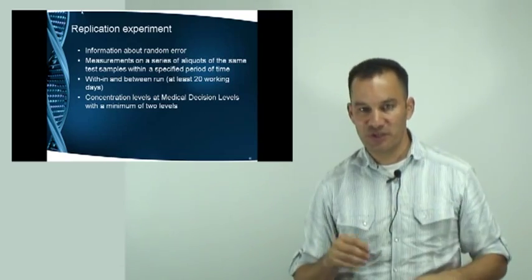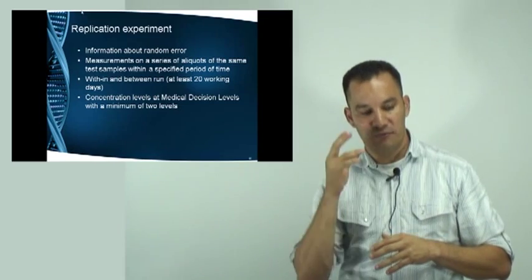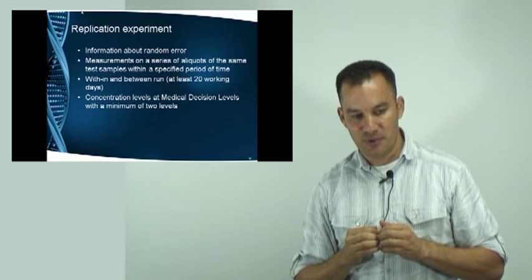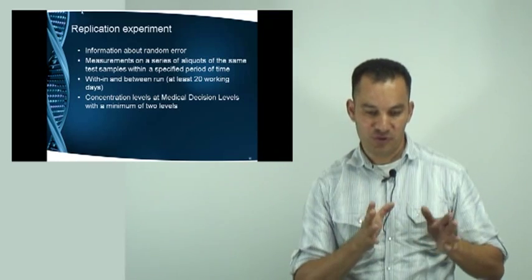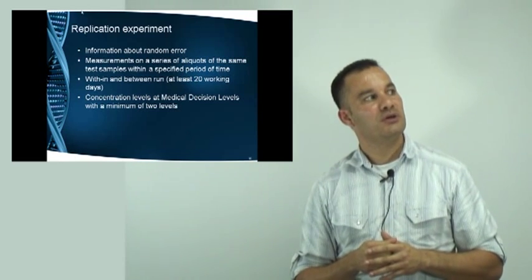The concentration at which we have to perform those experiments is being decided by the medical decision levels. You have to realize for yourselves that sometimes physicians have certain concentration levels of certain analytes. For instance, let me give you one of those.